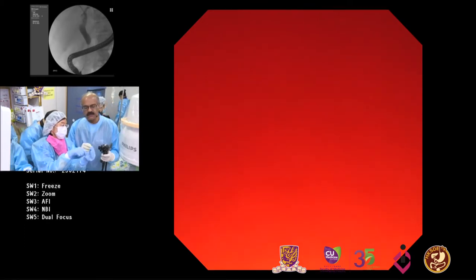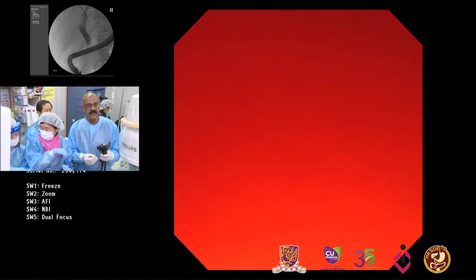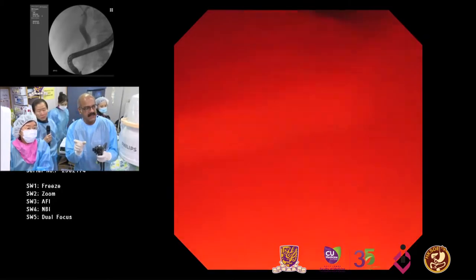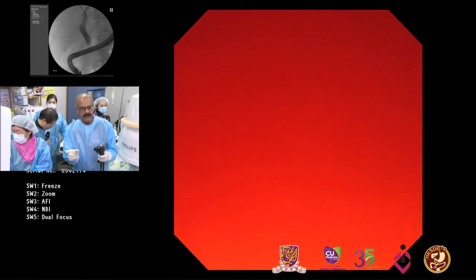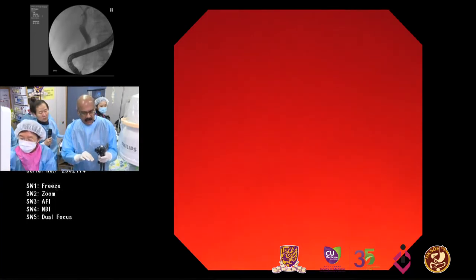Okay. So what we're going to do is, first I'll show you this electrode. You can see that in spite of the fact there's a long stricture, I've selected the shorter electrode of 1.8 or 2 centimeters. The reason why I do this is, in our experience, and also with animal work, we have found that the shorter electrode is better than the longer one of 3.3. So I select the short, although I have to overlap and do it several times.